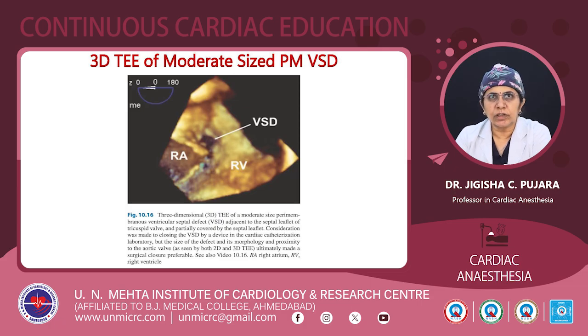Another 3D view, of a moderate size perimembranous VSD. This is a 3D view of a moderate size perimembranous ventricular septal defect adjacent to the septal leaflet of the tricuspid valve. Here you can see the VSD near the tricuspid valve, partially covered by the septal leaflet.